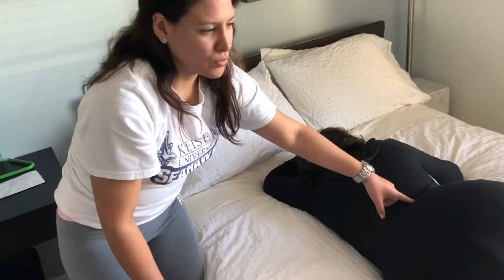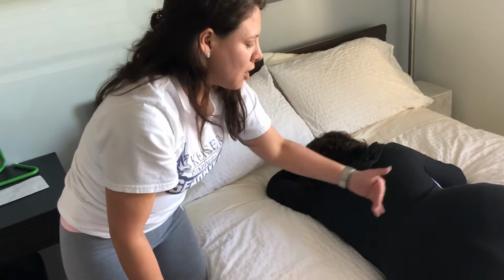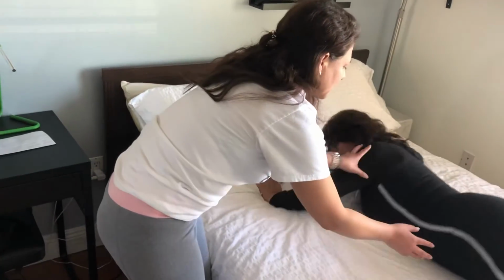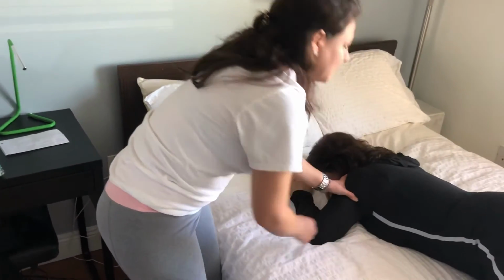For the RAO, it's gonna be the opposite. Turn the same way to the other side, please. Okay, thank you. So for the RAO it is the same.